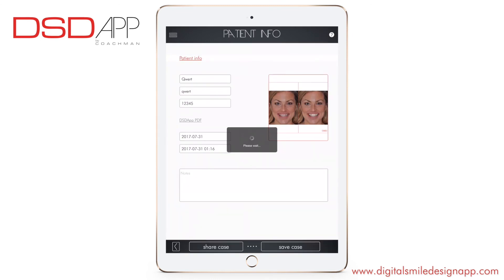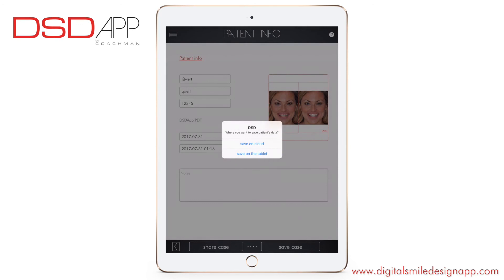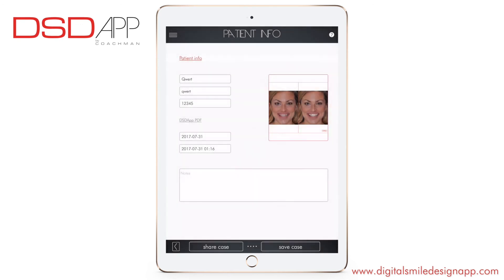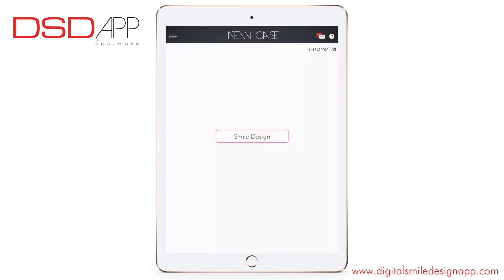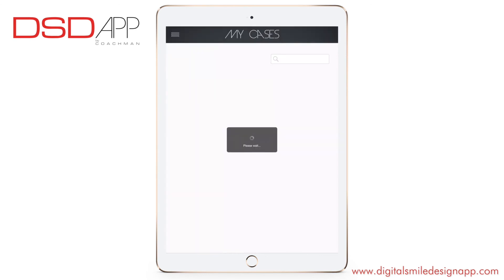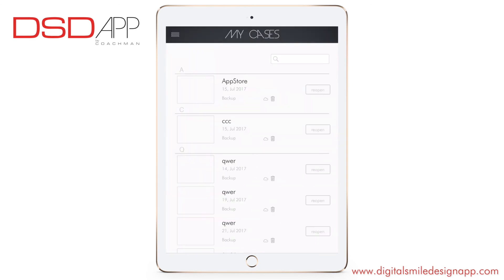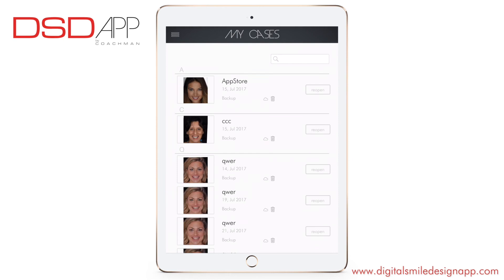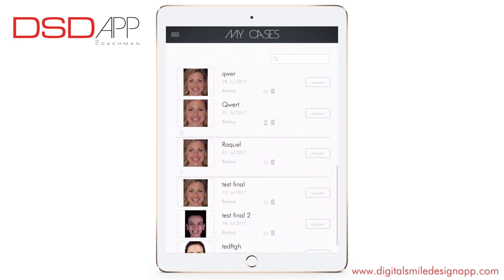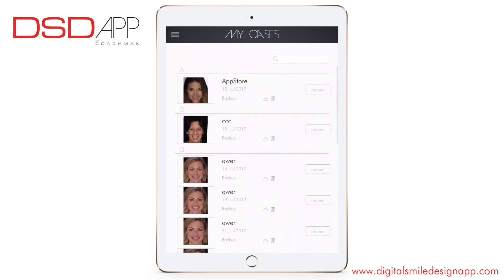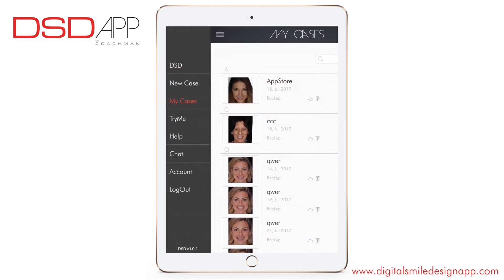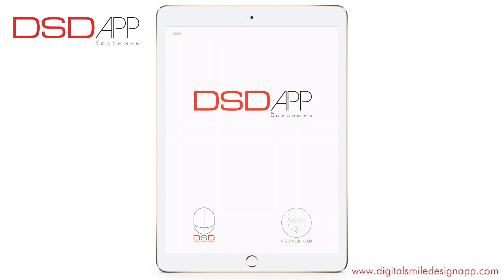You can save the case on cloud or tablet. Go to my cases — you can reopen a case, and here you'll find the portfolio of your smile designs. Thank you very much.